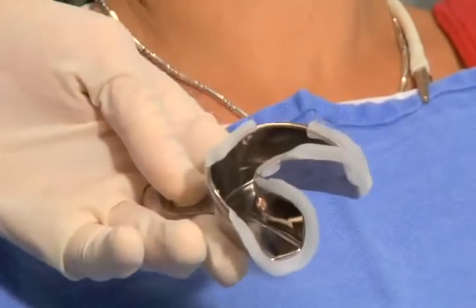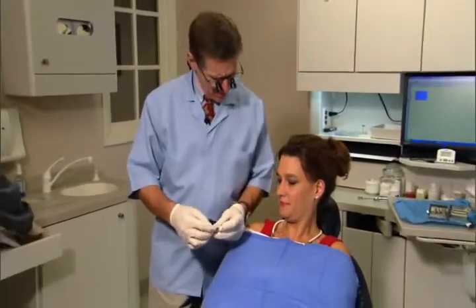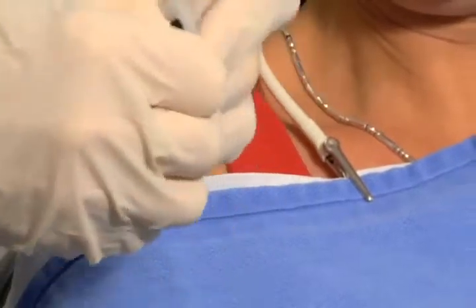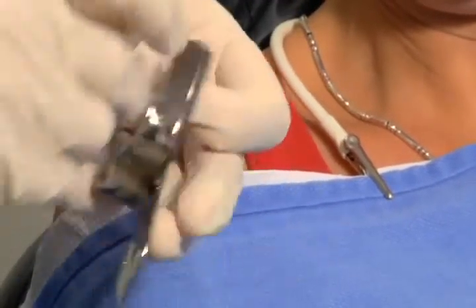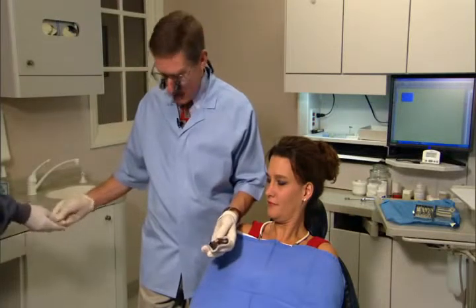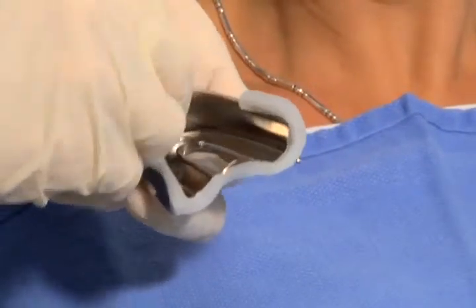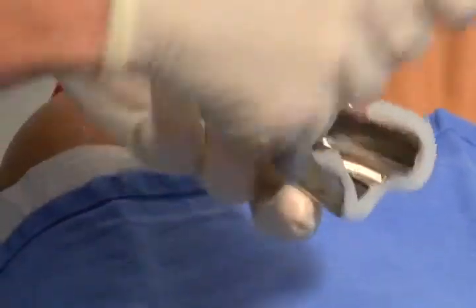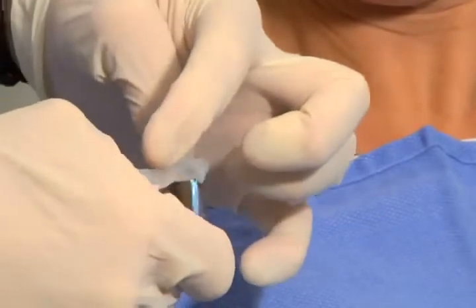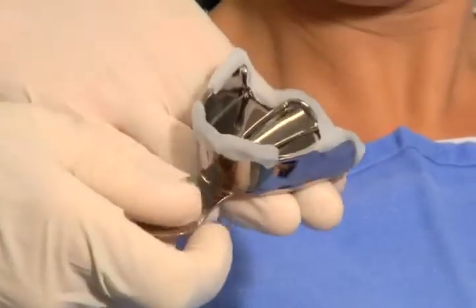For a denture patient I cover the whole tray, but not for her. On the upper, I put a post of clear rope wax — Modern Materials brand — on the back end to help contain the alginate within the tray, and a little piece in the front. When I border-mold or muscle-trim this impression, if the frenum runs into it, it'll cut into the wax instead of the metal tray. Now we've got wax on our trays.